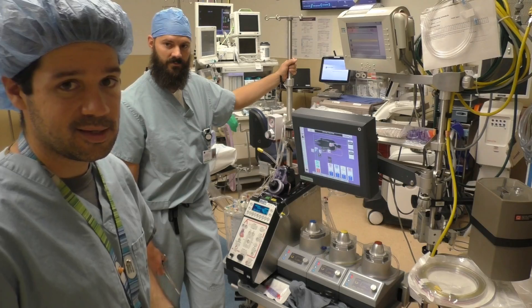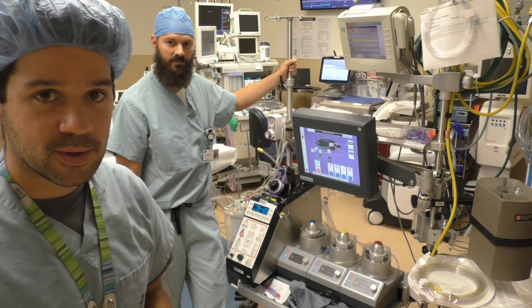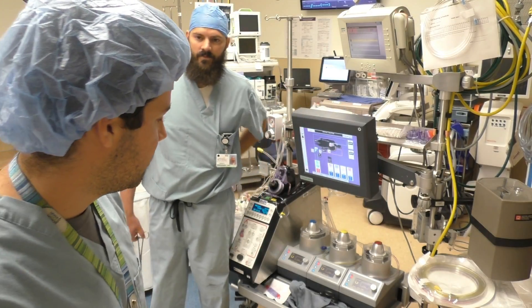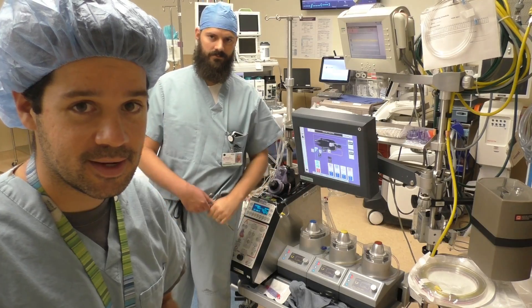Alright guys, that's basically the perfusion machine. We tried to give you a simplified version of this heart-lung machine and hope you guys enjoyed the video. We'll see you again next time.